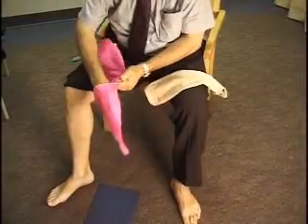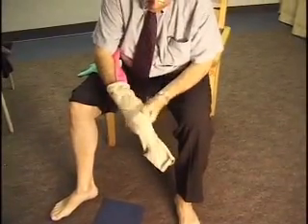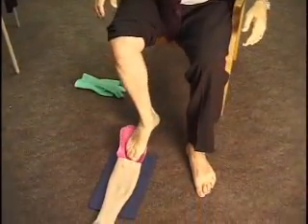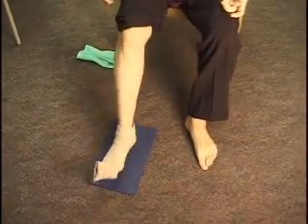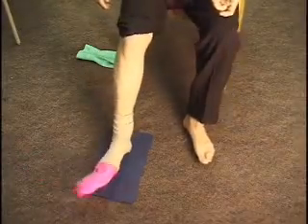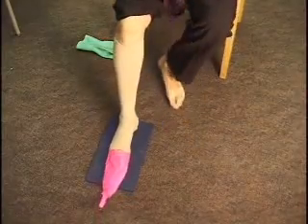Open-toe stockings may be applied with the use of a large slipper. First, place the device inside the stocking. Shown here is a heavy rubber stocking, which is normally difficult to put on. Next, the stocking and the slipper are advanced over the heel with pushing motions as seen here. The heel can be adjusted also by sliding back and forth over the rubber pad.